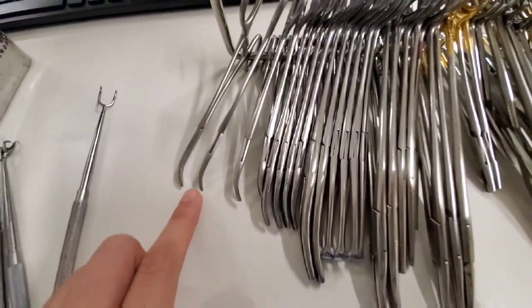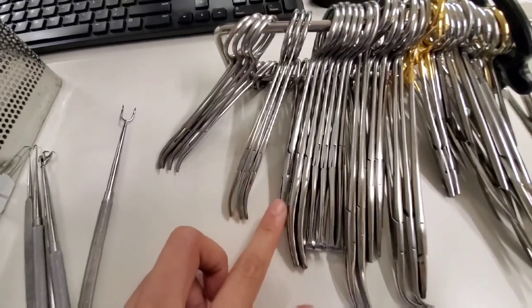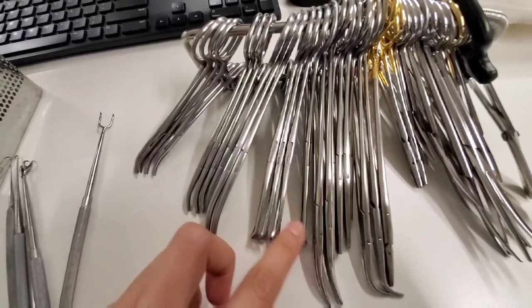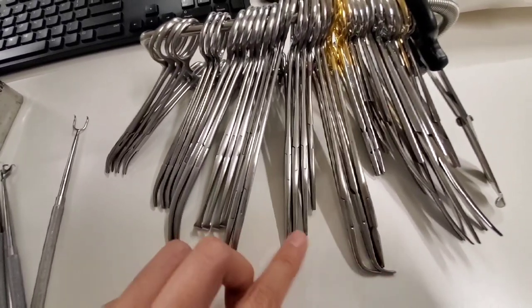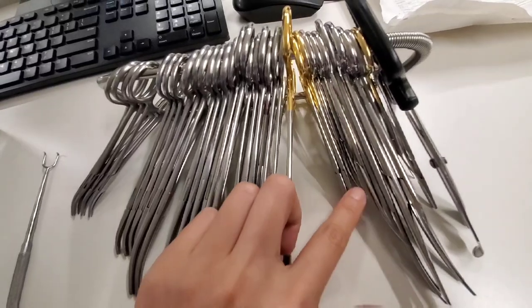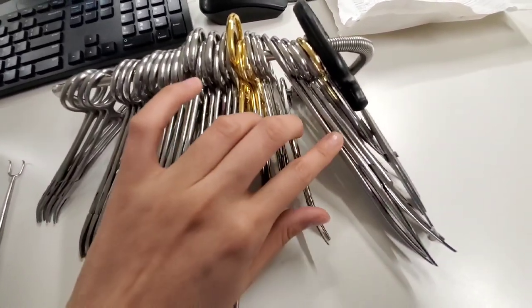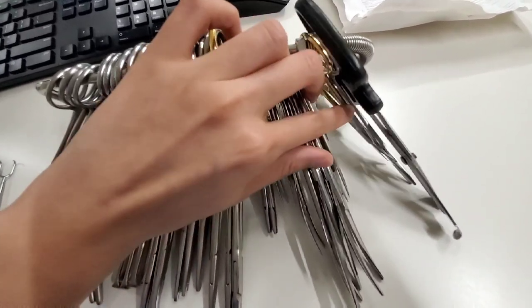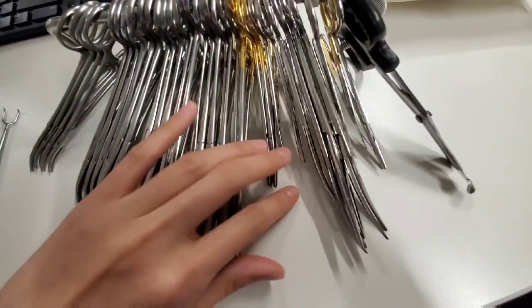These are: one, two, three, four Criles; one, two, three, four hemostats; one, two Kellys; one, two, three, four Allis; two tonsils; one, two, three, four Kochers; two right angles; needle drivers one, two, three; scissors one, two, three, four, five, six, seven, eight, nine, and ten. They each have a name.